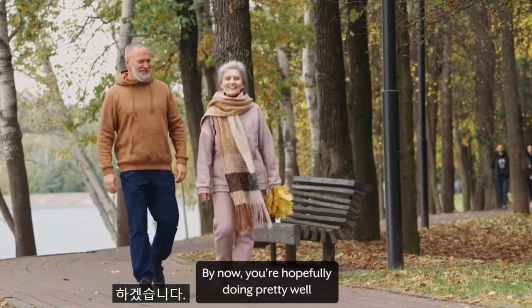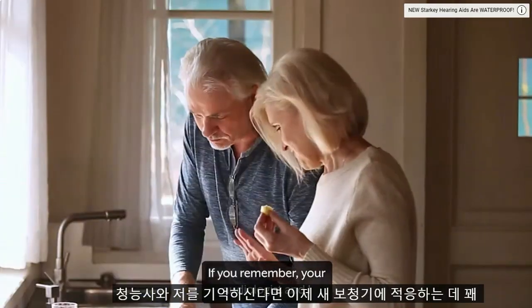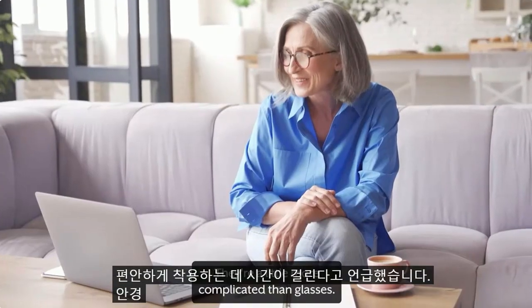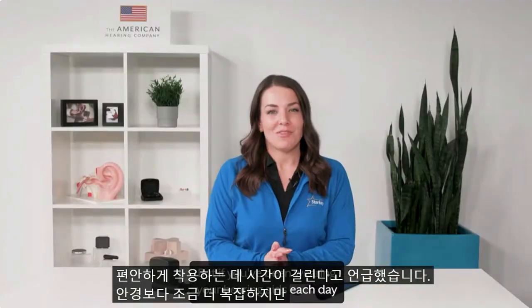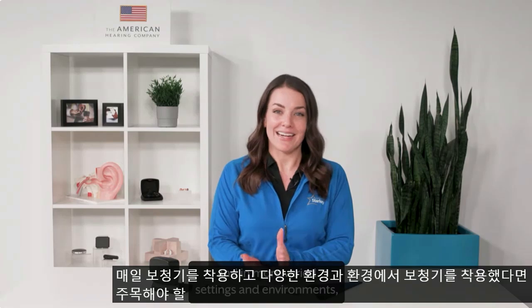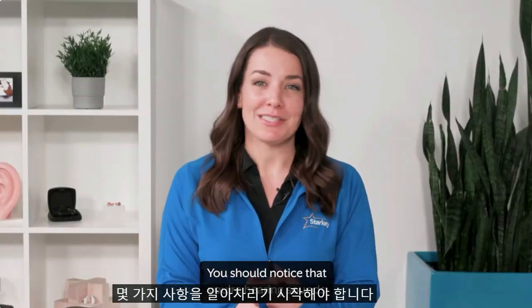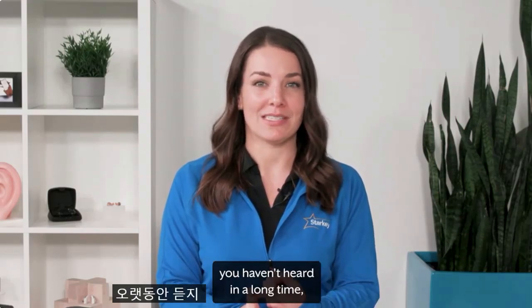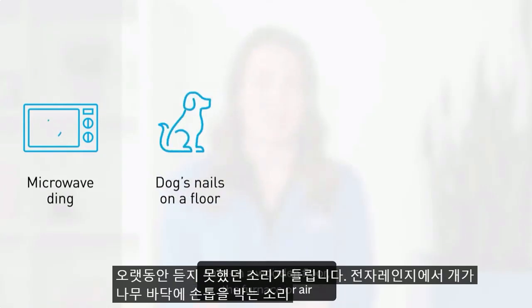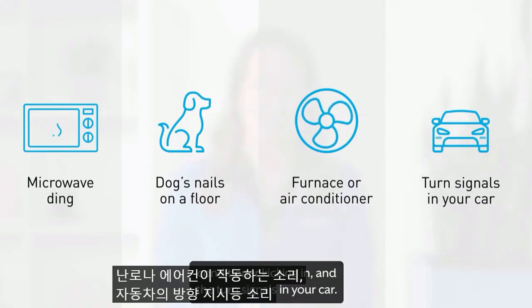By now, you're hopefully doing pretty well adjusting to your new hearing aids. If you remember, your audiologist and I mentioned it takes a while to get comfortable wearing them. They're a little more complicated than glasses. But if you've been wearing your hearing aids each day and in more varied settings and environments, you should start to notice a few things. You should notice that you're hearing sounds you haven't heard in a long time. Sounds like the microwave ding, your dog's nails on a wooden floor, the furnace or air conditioner kicking in, and the turn signals in your car.